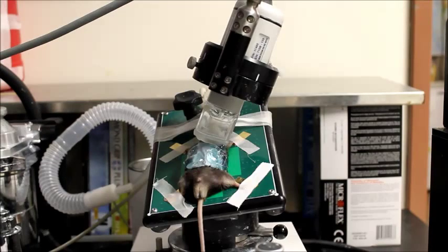To obtain the pulmonary diameter, the 25 MHz probe is switched for the 30 MHz one. The table is switched to a 60 degree elevation as if the mouse was in a standing up position. Then the table is slightly rotated 5 degrees towards the right side. The probe should be maintained in a short axis view orientation.